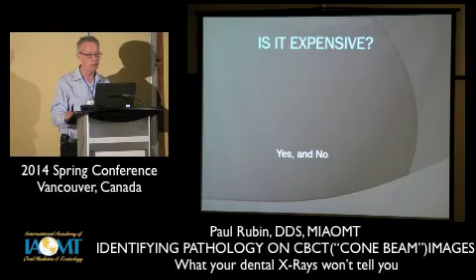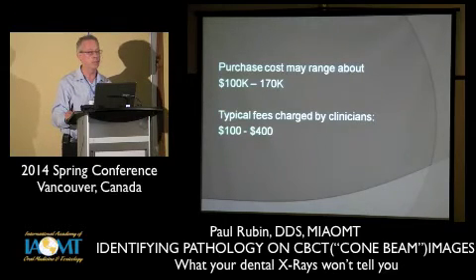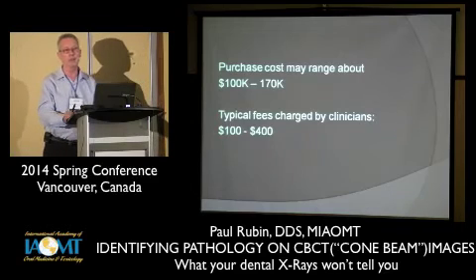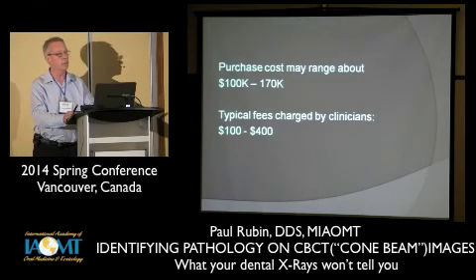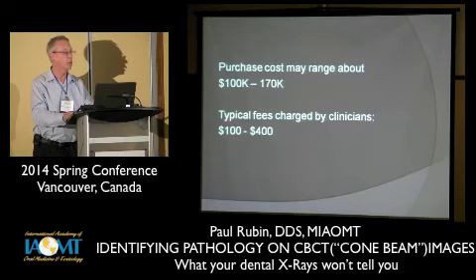Yes, they're expensive. Again, I got some of this information from that clinician's report article. The cost may be somewhere between $100,000 and $170,000. I don't know how this translates to monthly if you're leasing it or buying it over time. But you have to figure out those numbers versus how many images you think you would take a month, and what you are going to charge for them. Typical charges are going to be somewhere between $100 and $400 per image.